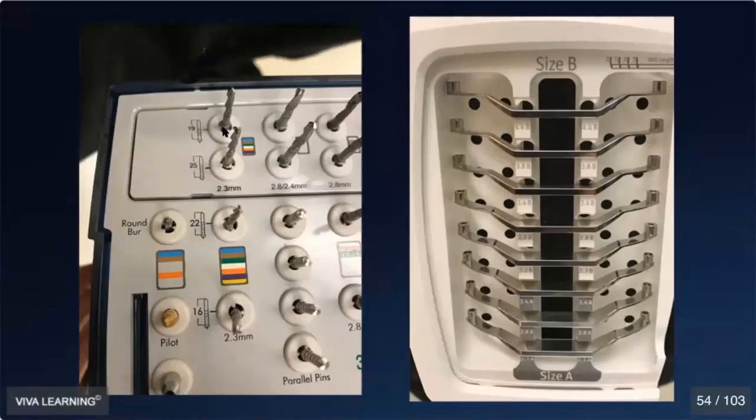Well, if you're in the posterior and you're having clearance issues, which is very often the case, then you can go with a really short drill length, even if that's not necessarily the most appropriate drill length from the manufacturer's perspective. It just gives you the flexibility to select what's most appropriate. And very important too, if you're using a system that uses guided drill keys, you should consider the key length in the overall equation as well.